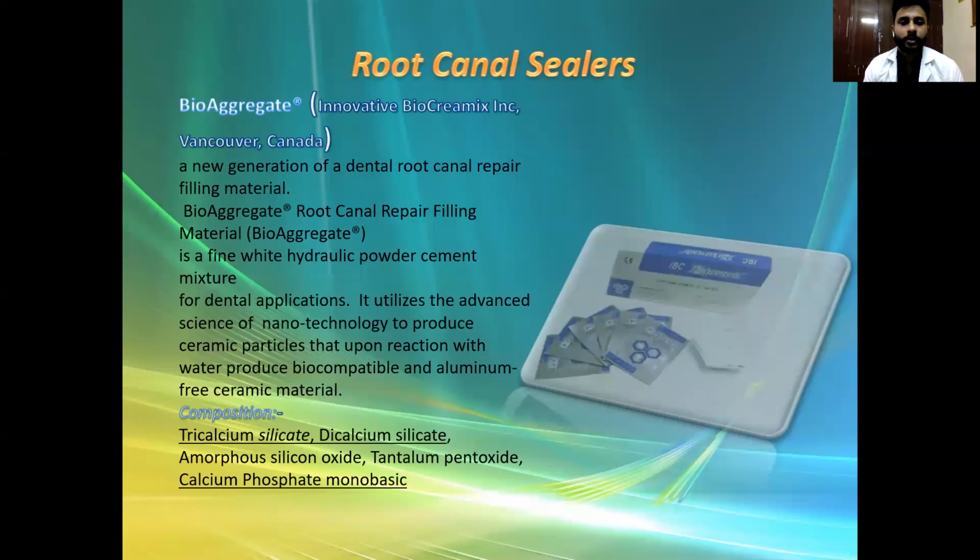And BioAggregate is also a new root canal sealer. It is composed of tricalcium silicate, dicalcium silicate, amorphous silicon oxide, tantalum pentoxide, calcium phosphate monobasic. It utilizes the advanced science of nanotechnology to produce ceramic particles that, upon reaction with water, produce biocompatible and aluminum-free ceramic.